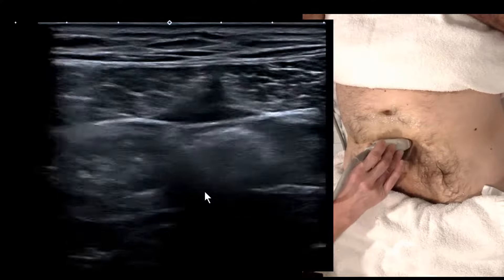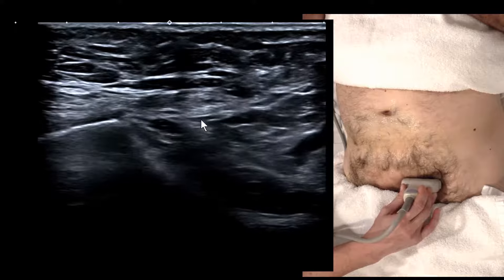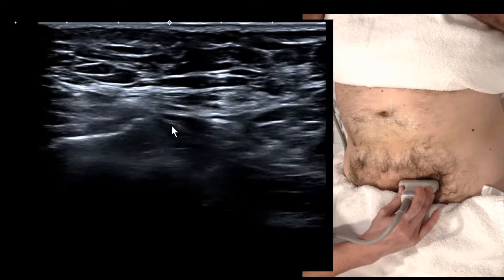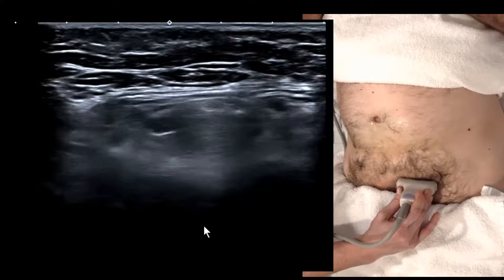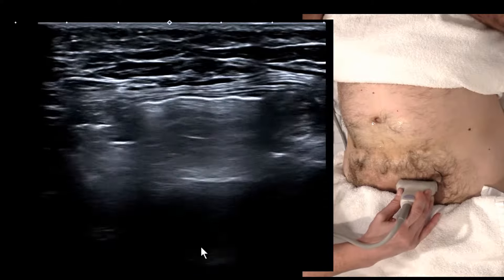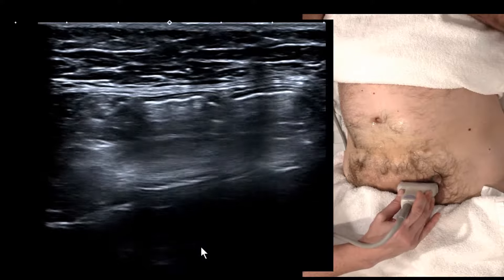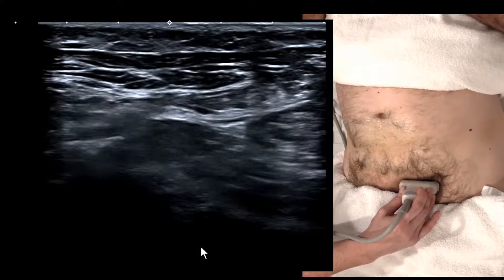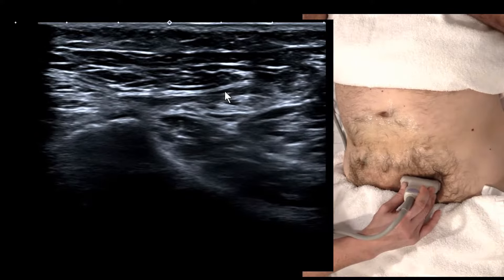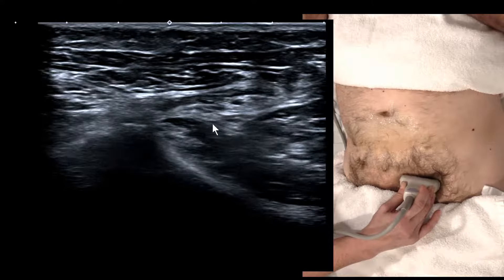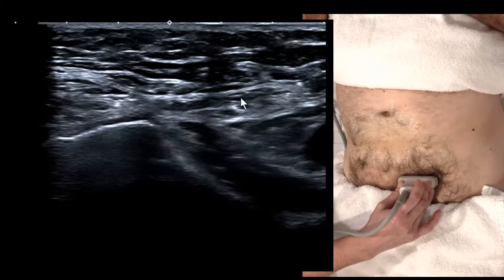Lots of transverse sweeps looking for a bulge on strain. At a basic level, ask the patient to strain — you'd pick up most hernias. The only difficulty is we can't tell from that position if it's indirect or direct, because they both exit at the same point — the superficial ring.